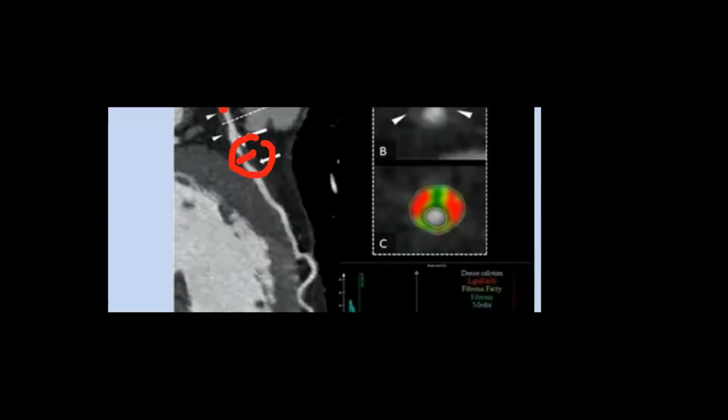Okay? So, generally speaking, cardiac CT provides you characterization and quantification of the plaque, which goes way beyond the quantity itself to the vulnerability and the components of vulnerability. So you will have more information than invasive angio can provide you about the plaque.